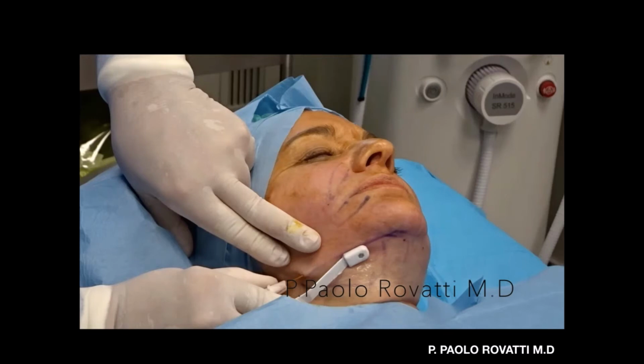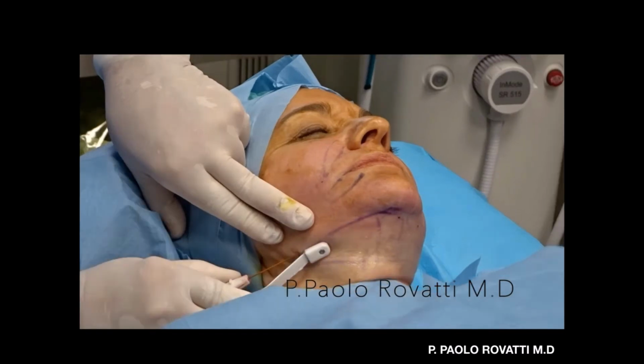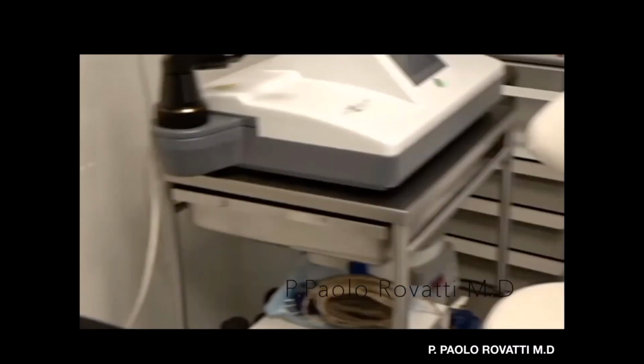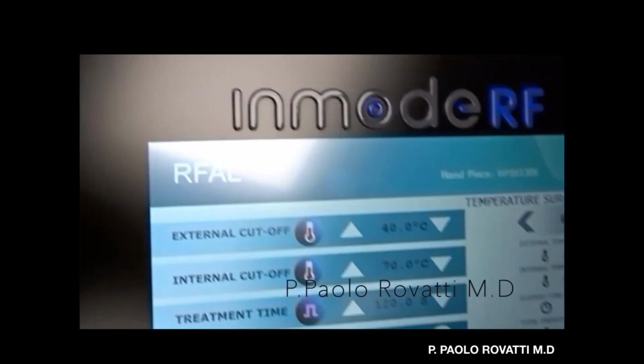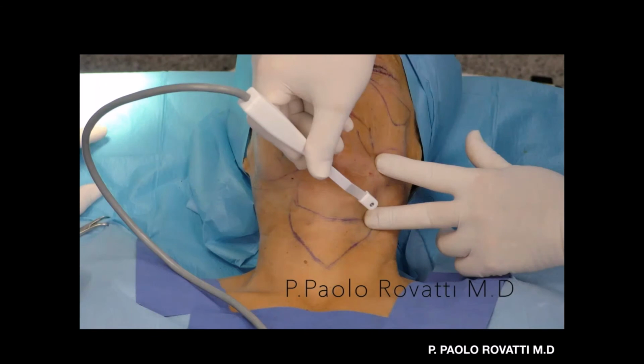Sometimes it's better not to start alone with this technique, because heating sometimes gives really good results, but sometimes not. Look, now I'm treating and I want to show you that it's not fake. This is 40, 70 degrees, and now I'm treating 2 kilojoules and I have a temperature. This is the treatment we do just in the neck, but I think we can go to the hand, because now you have seen what you have.